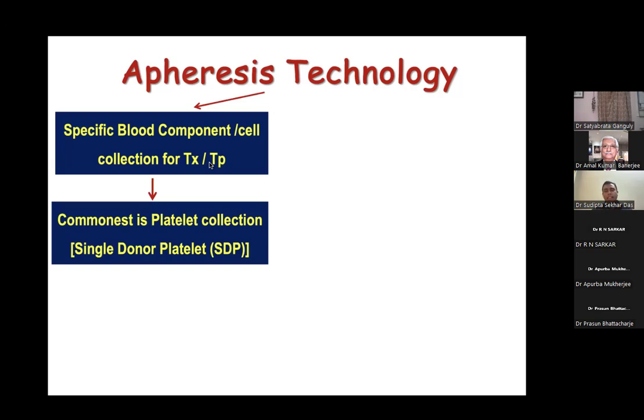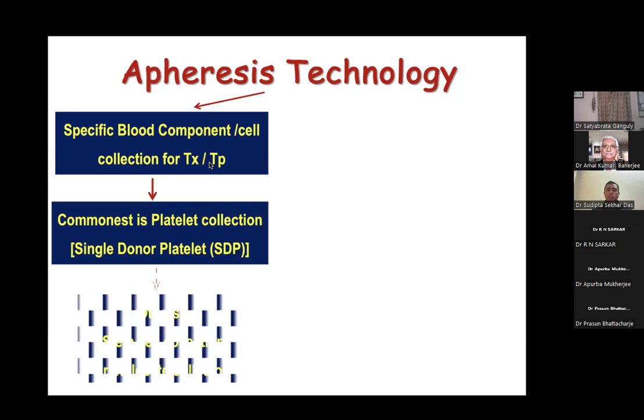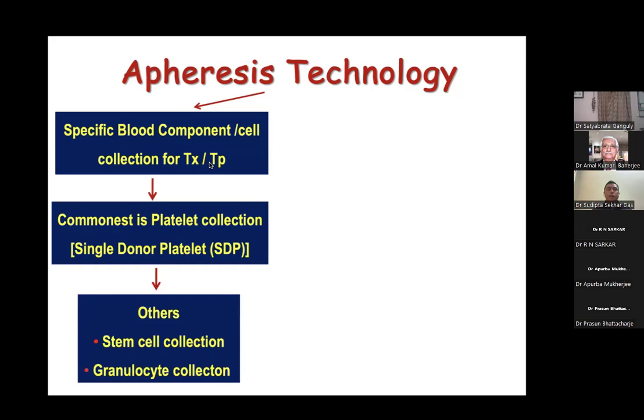And on the right-hand side, you can see the therapeutic application of apheresis technology, where apheresis is used for the patients, right? So in most of the cases, why is this technology used? Just to remove the antibodies, or it may be lipids, it may be toxins, it may be endotoxins, it may be bilirubin, it may be bile acids, and a lot more, right? Any pathological substances can be removed by means of apheresis technology, depending upon the indication.